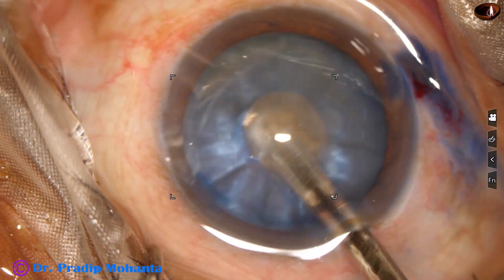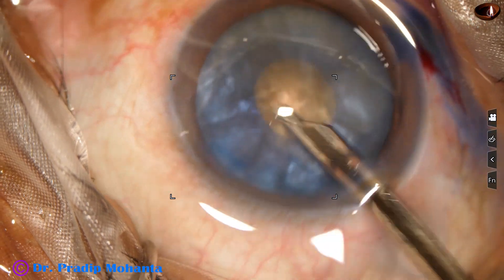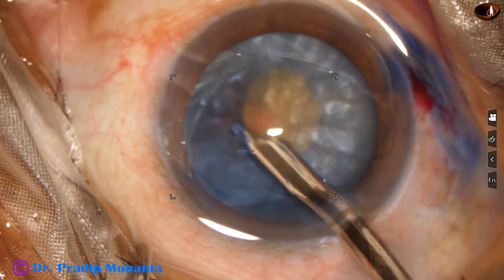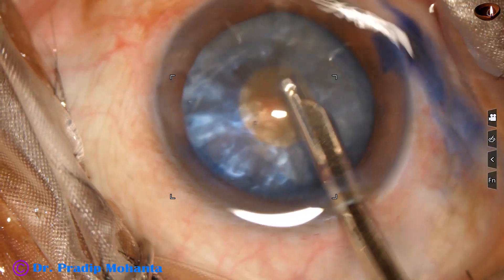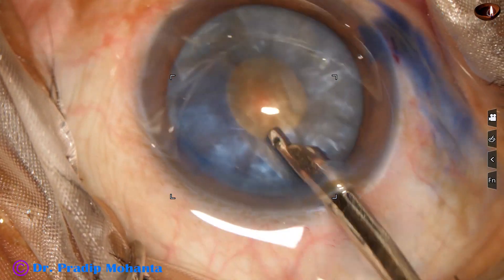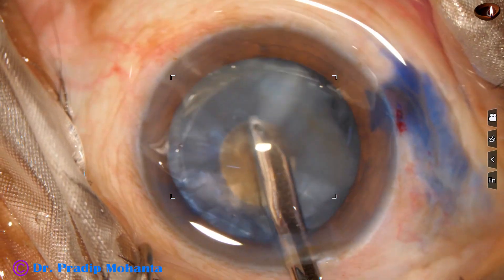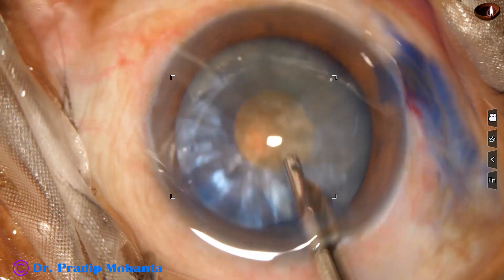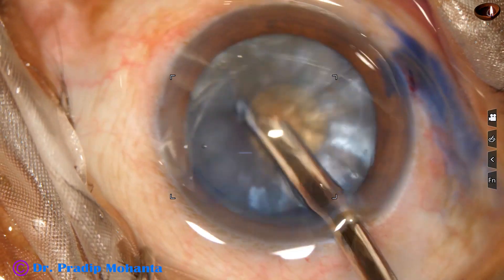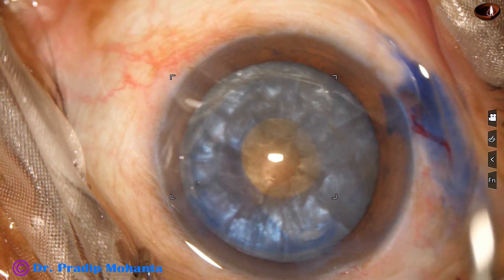Now I use a Simcoe cannula to remove some cortex. Tap on the nucleus and hydrodissection occurs. The nucleus starts rotating, and as I rotate the nucleus, a lot of cortex comes out along the equator and is removed.